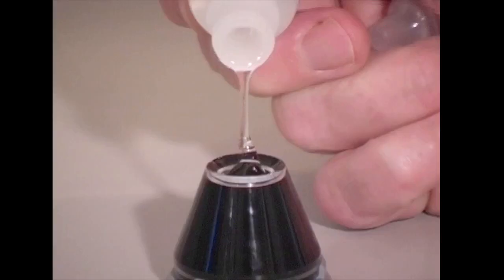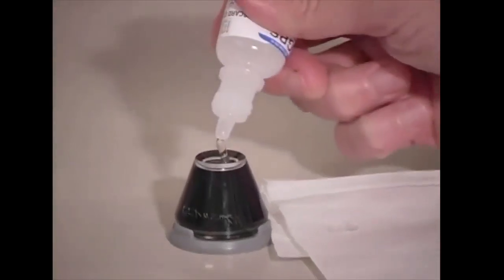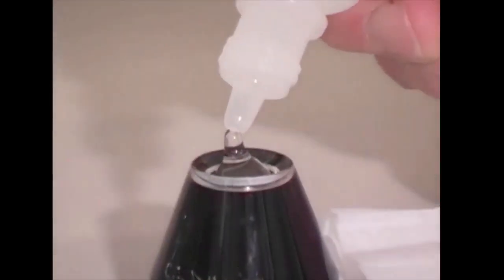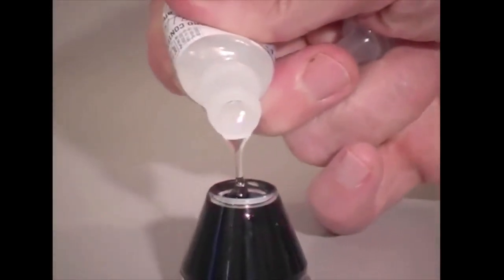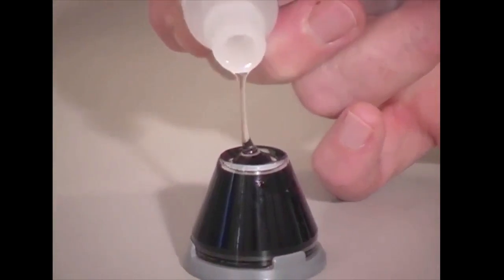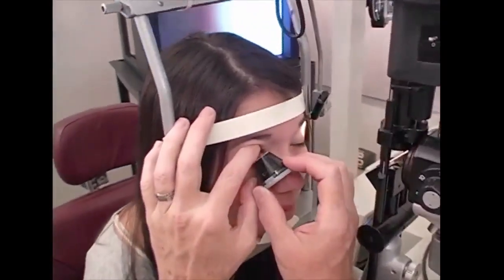Goldmann style lens, one needs to use a coupling solution, usually methyl cellulose. So it's important that that's done without bubbles. I can either start the methyl cellulose stream on a tissue and transfer it over, or I can break the tip out and just dump the methyl cellulose into the concavity of this lens. Both of those work pretty well. Patient is anesthetized, of course.